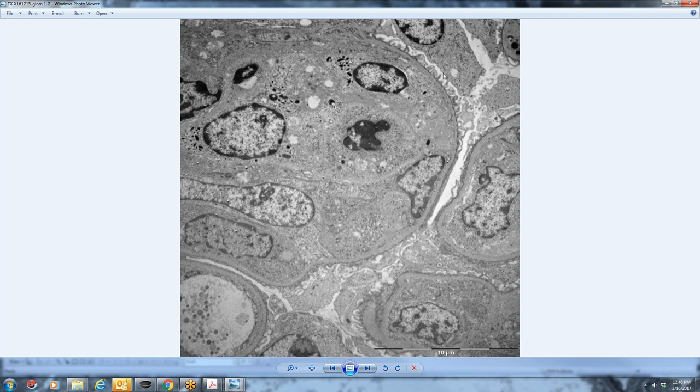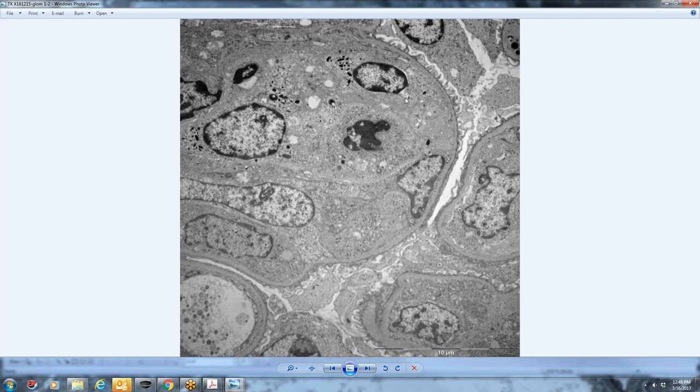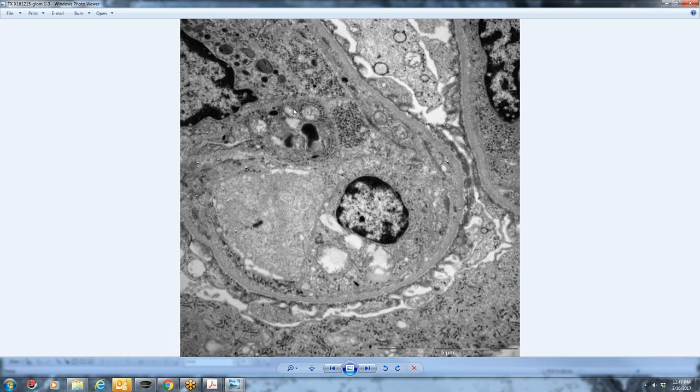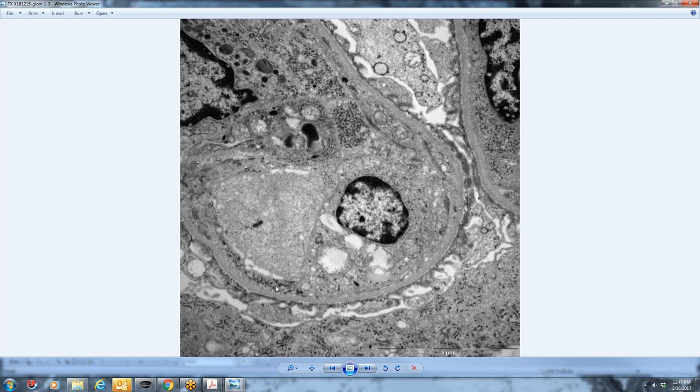And the fact that a lot of the podocyte foot processes have remained pretty healthy-looking kind of does suggest that it's a good quality specimen. We have numerous nuclei in here. Some of them look like they have granular material, like granulocytes. So it looks like they have little granules within their cytoplasm, although the nuclei do not look like granulocyte nuclei. So they're more of a round nucleus. But again, very hypercellular glomeruli.